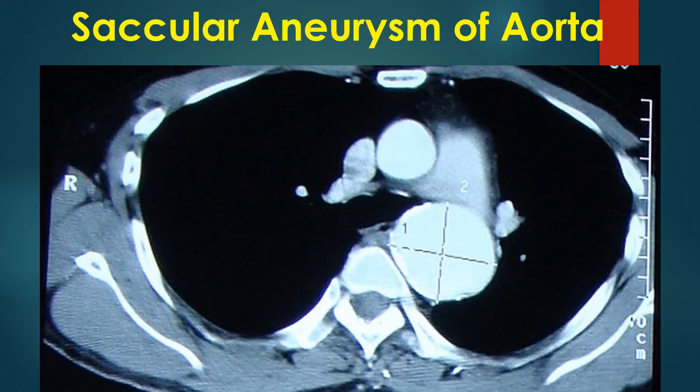CT scan demonstrates the aneurysm very well. The wall of the aneurysm is partly calcified. The aneurysm measured about 5.5 cm and was saccular.